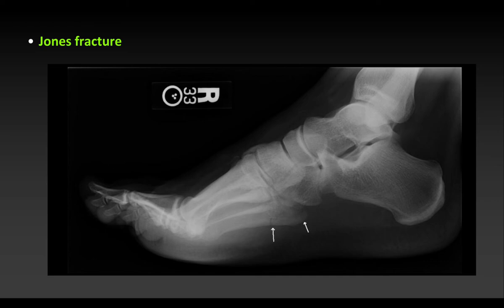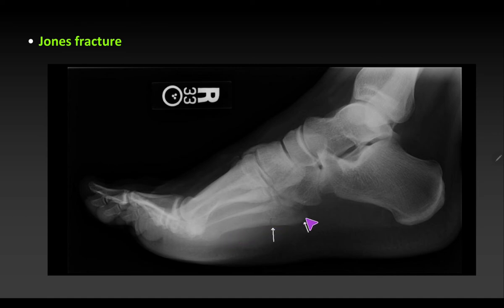On the lateral view, the Jones fracture can also be appreciated — you can see a small crack at the base of the fifth metatarsal, which is the lowest bone in this view.